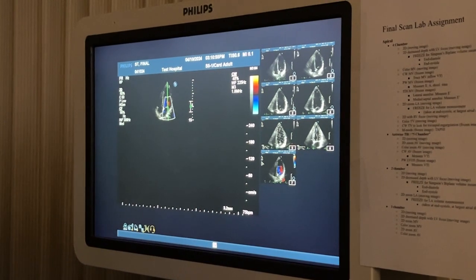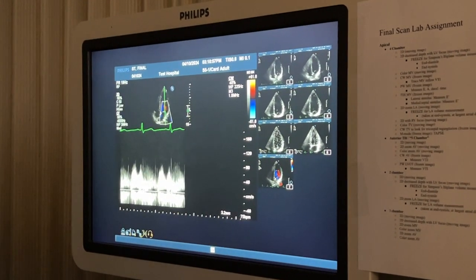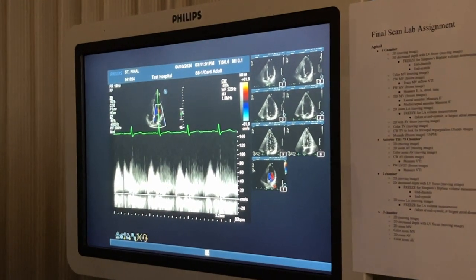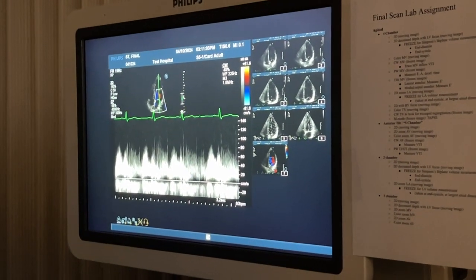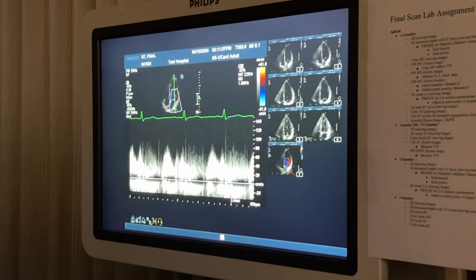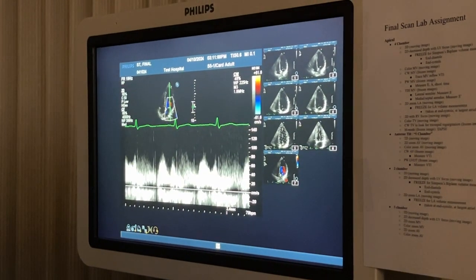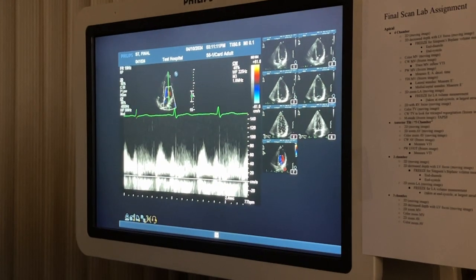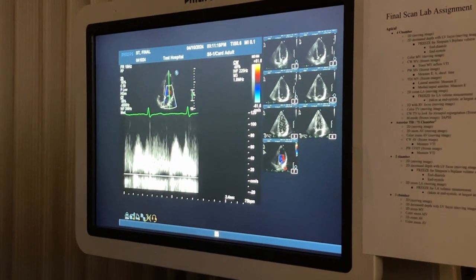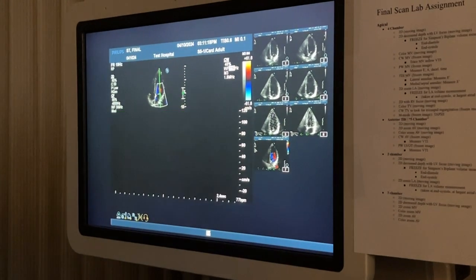We usually look at mitral valve inflow with pulse wave to look at our E and our A wave. It's the same here, it's just continuous wave, so it's showing us the highest velocity through the mitral valve. So the things that I'm doing right now, I'm just being really picky, and I'm adjusting my baseline, I'm adjusting my scale. Oh, your wall filter. A little bit. My wall filter I'm going to change to, yeah, decrease it.